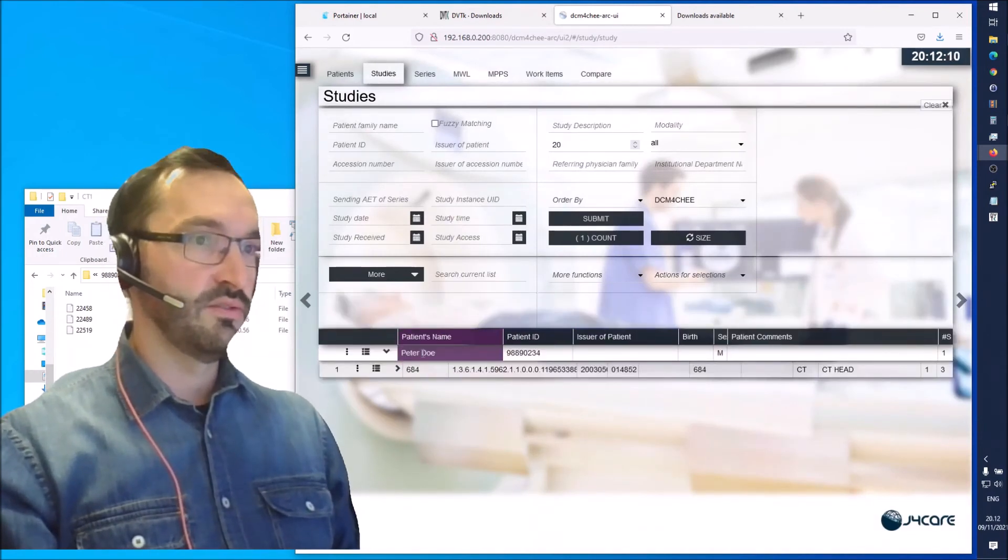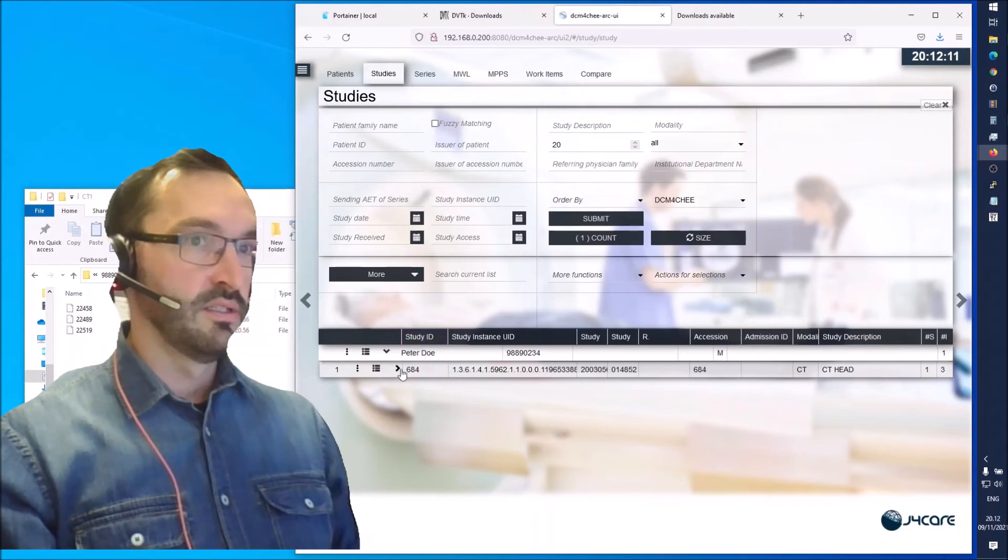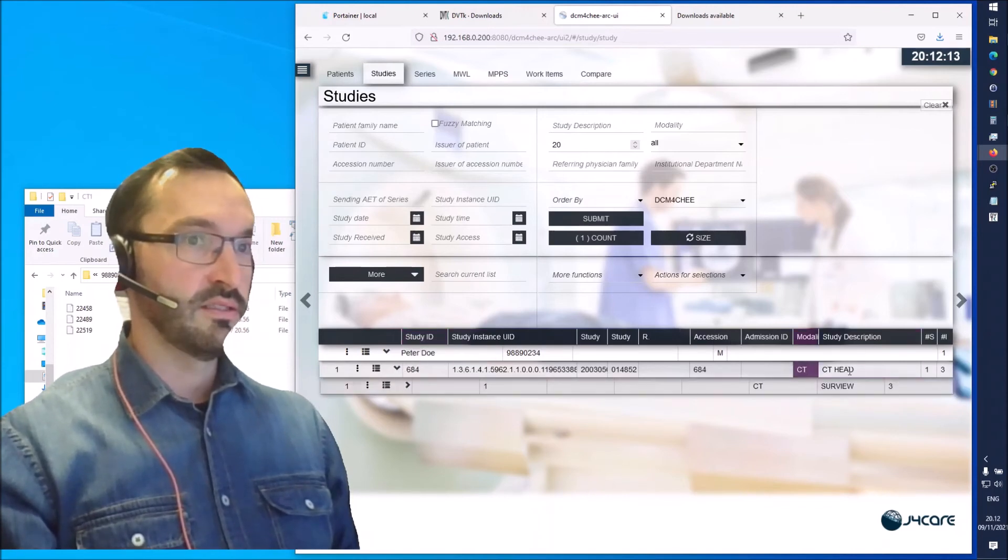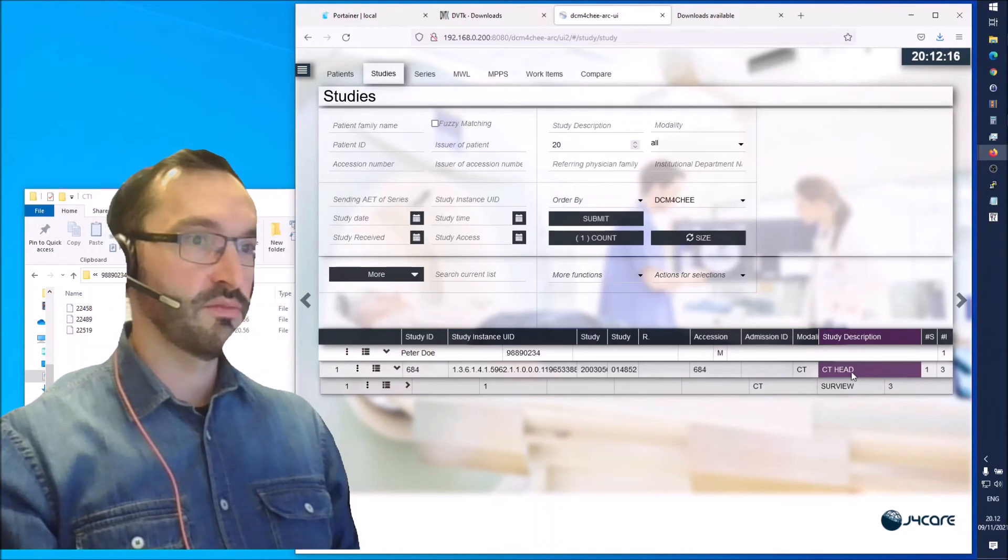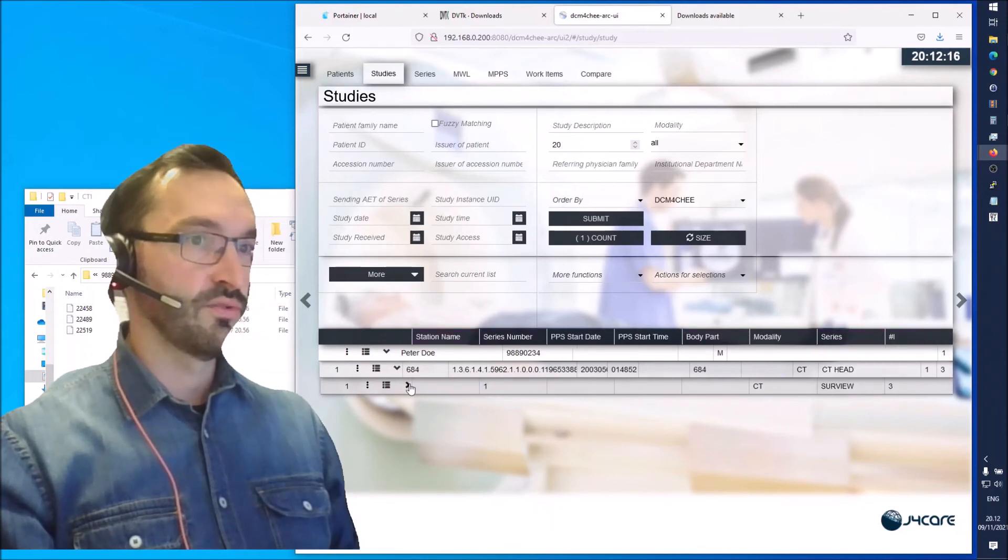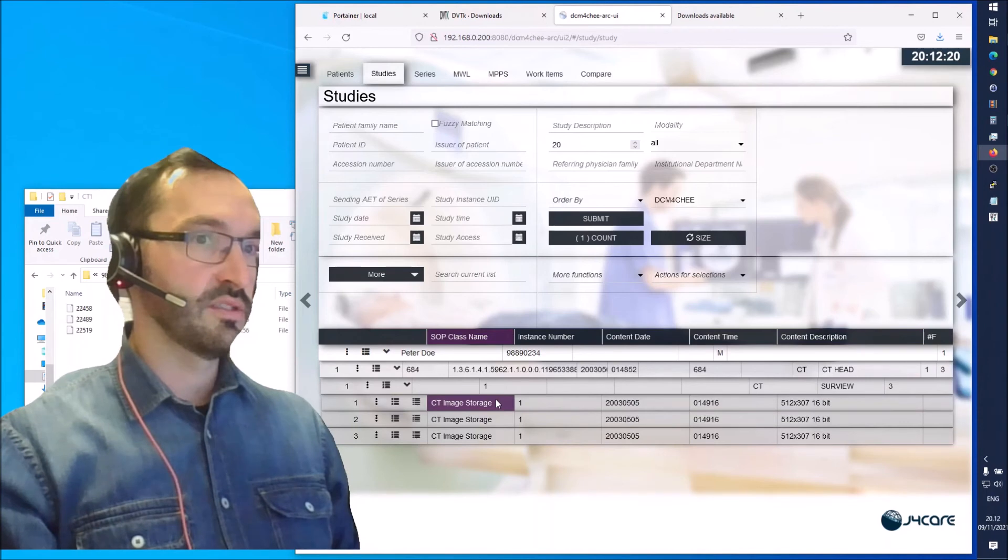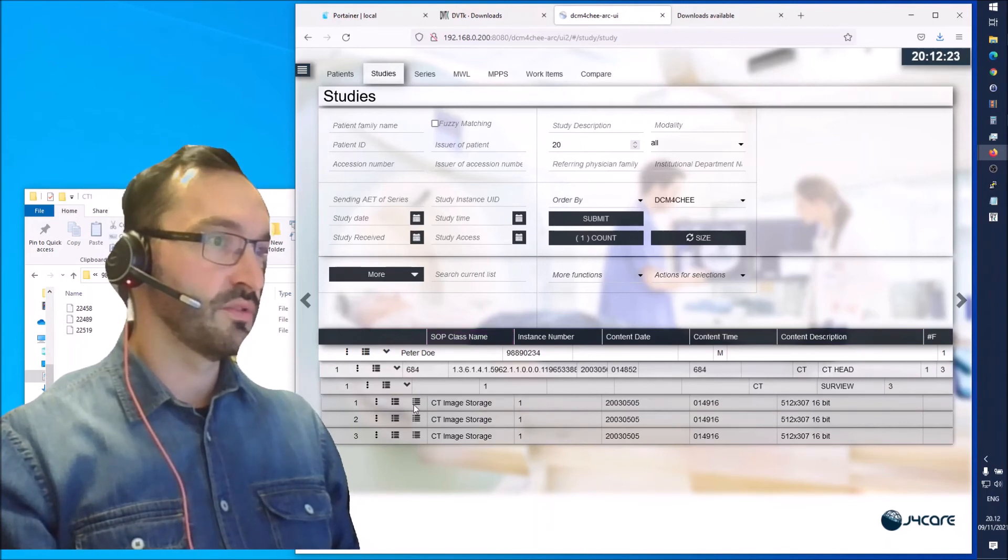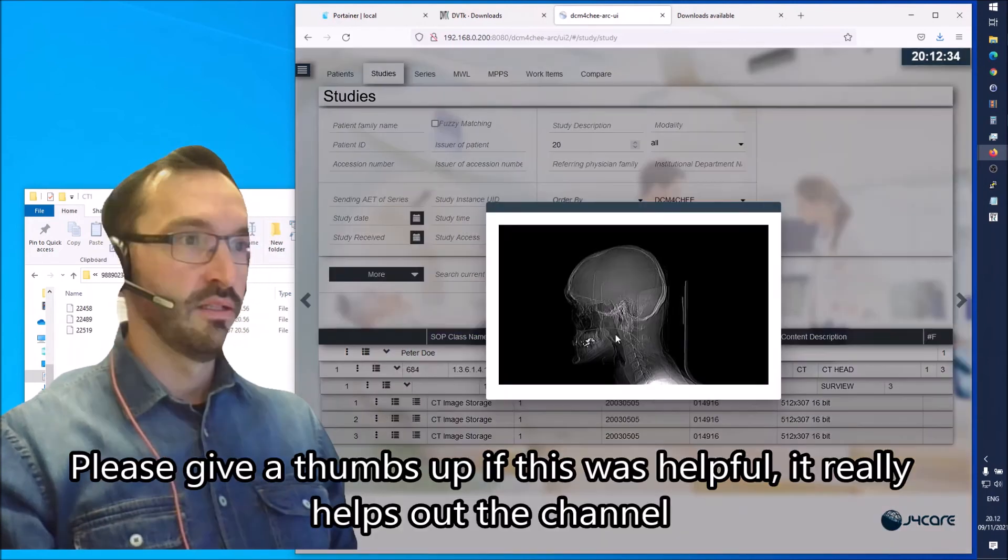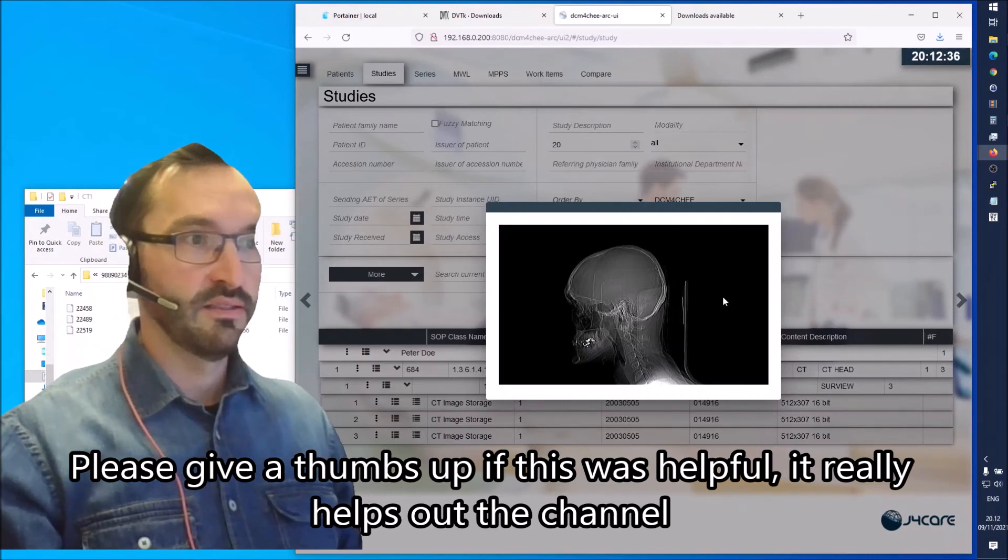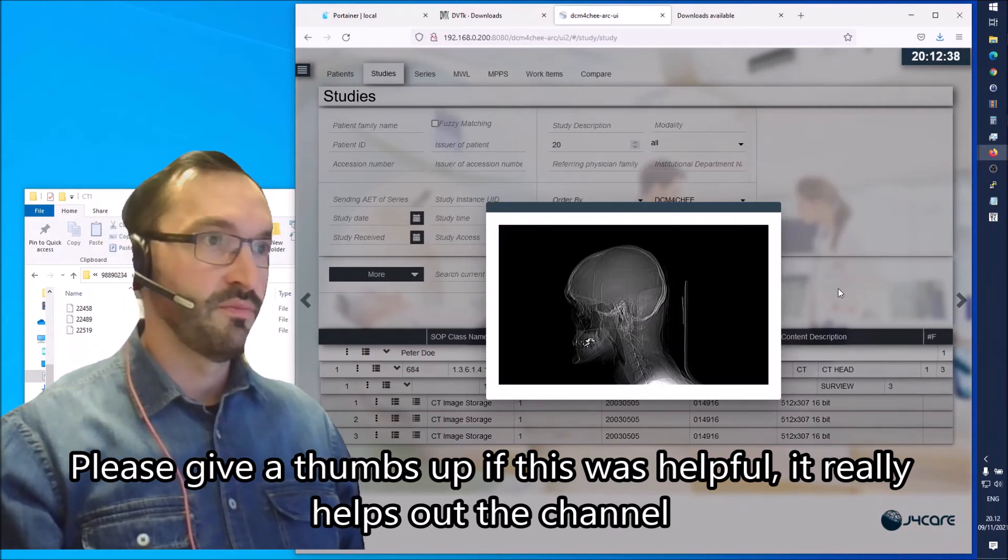Press on submit and we should see that study in the list here. It's Peter Doe. It's a CT study description. CT head should have three objects in here and we should be able to view the DICOM object. We can see that image here.